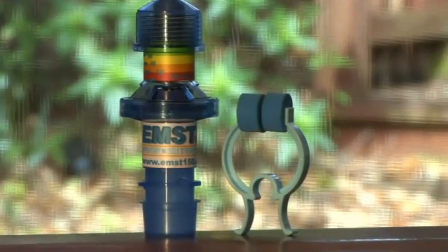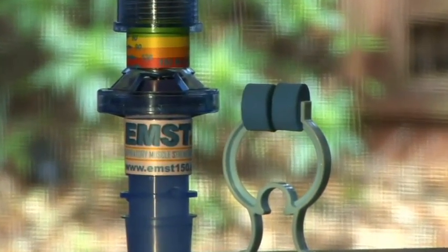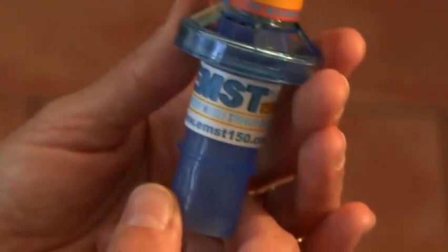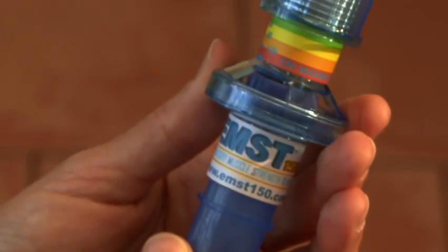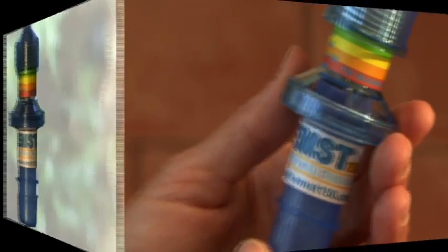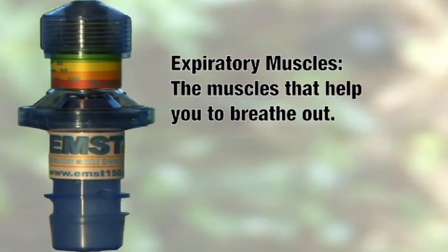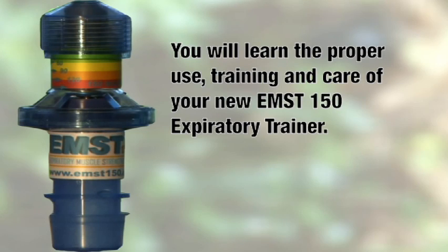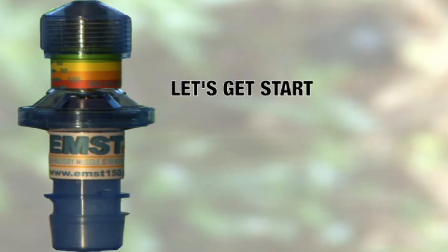Congratulations on your purchase of the EMST 150 expiratory muscle strength trainer. The trainer you have invested in is an exercise tool used to increase the strength of your expiratory muscles — the muscles that help you to exhale or breathe out. This video will guide you through the proper use, training, and care of your new EMST 150. Let's get started.